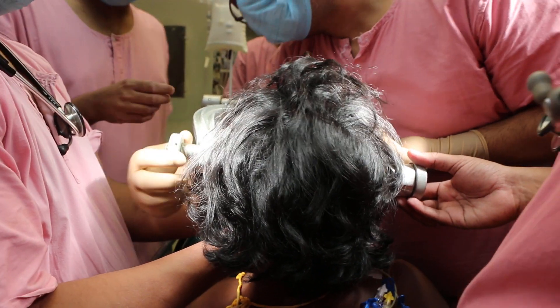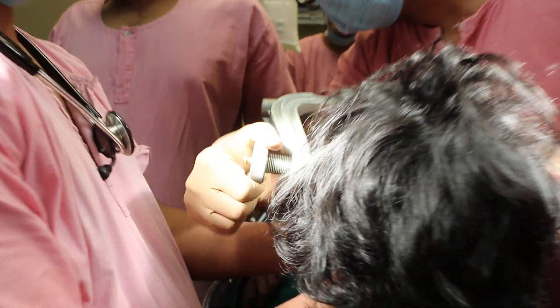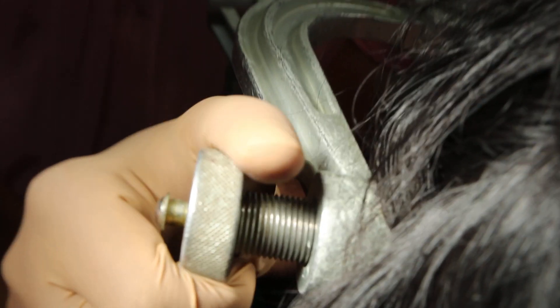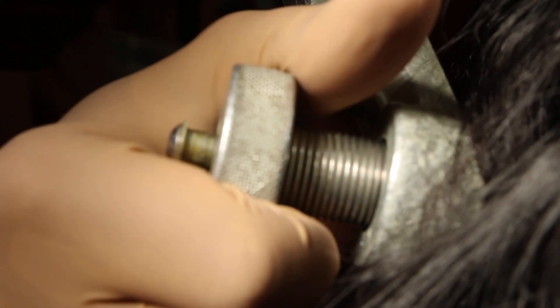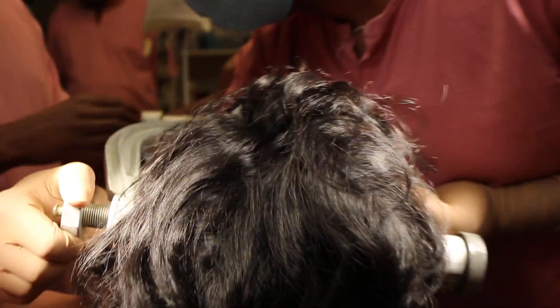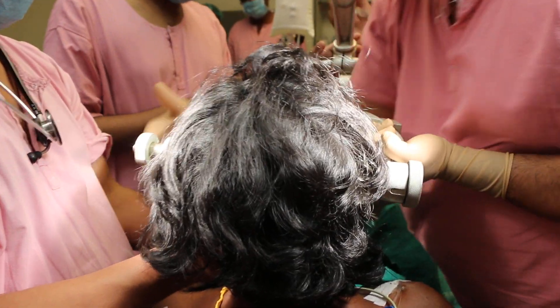Is it a bit down? It's not going to hold. Sixty would be fine, or even forty would be fine. So twenty, forty, and sixty. Okay, I think this should be fine.